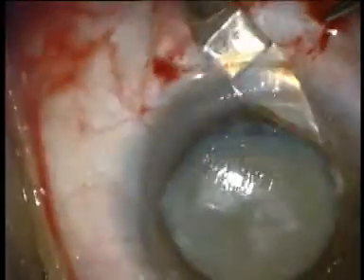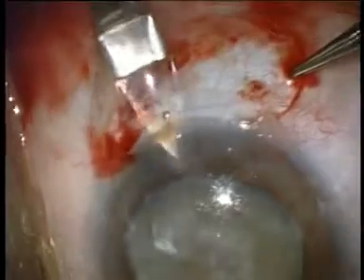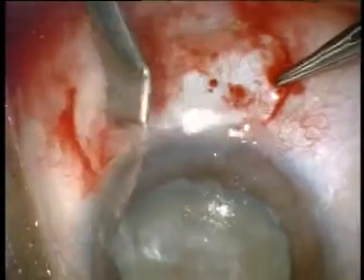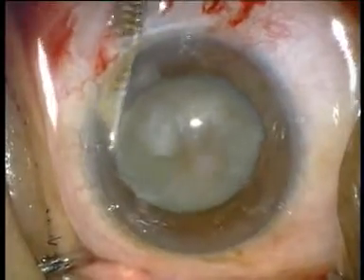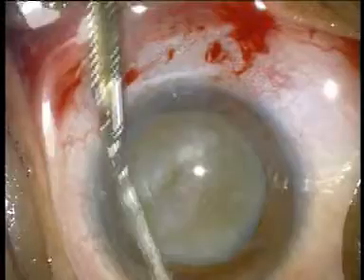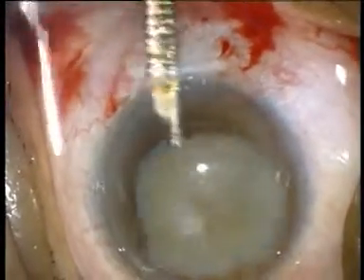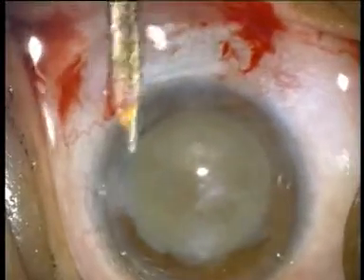The anterior chamber is now entered through the sclerocorneal tunnel using a lancet keratome. An irrigating Simcoe cannula delivers the nucleus into the anterior chamber by nudging one edge of the nucleus into the anterior chamber and then delineating the cleavage between the iris and the lens until the lens is entirely delivered into the anterior chamber.